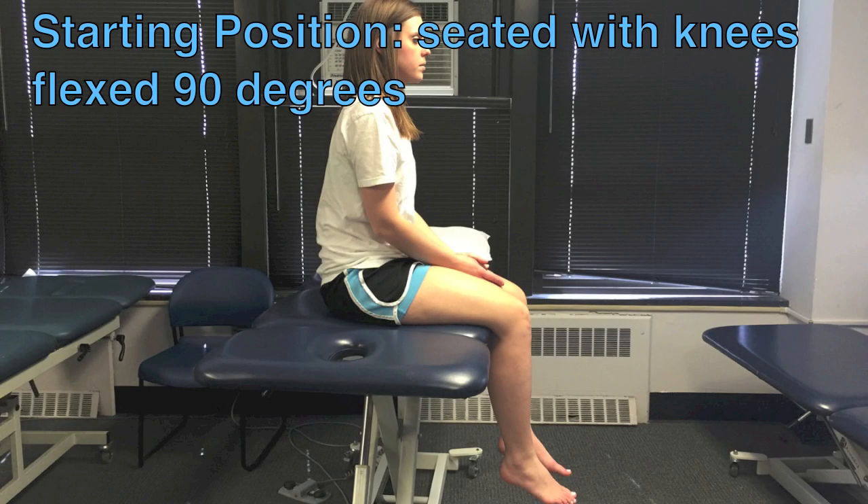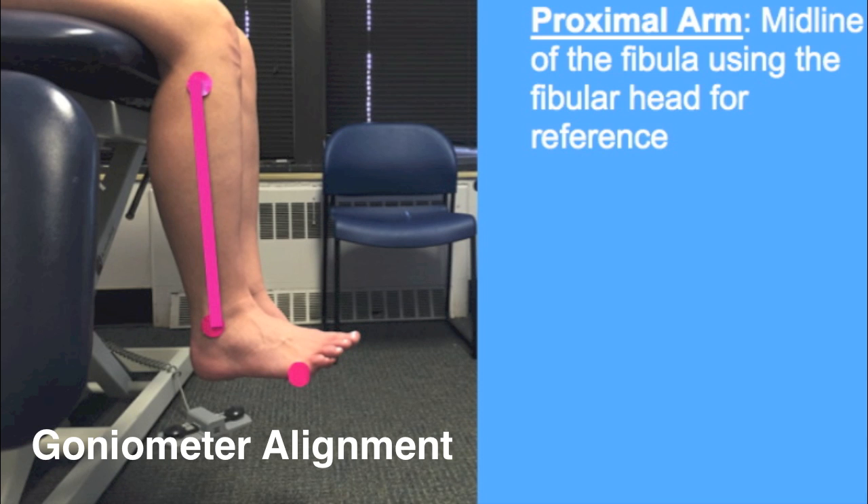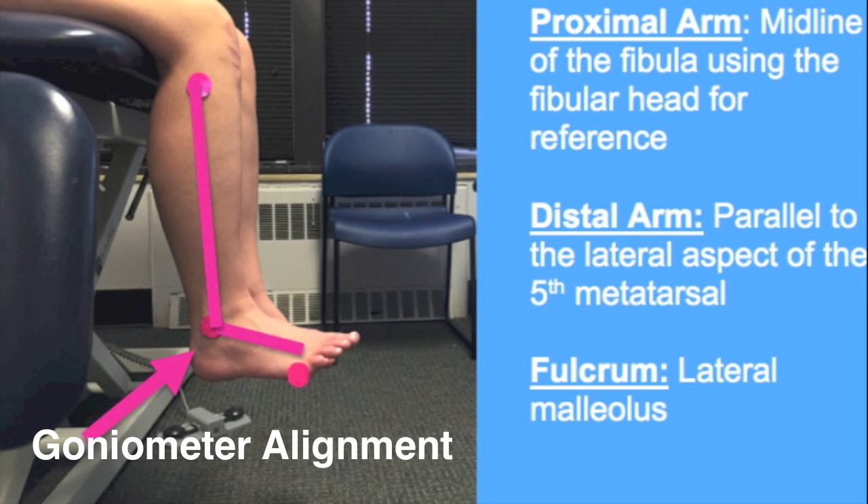The patient is seated with knees flexed to 90 degrees with the foot in 0 degrees of inversion or eversion. The following goniometer alignment applies to both ankle dorsiflexion and plantar flexion. The proximal arm should follow the midline of the fibula using the fibular head for reference. The distal arm should be parallel to the lateral aspect of the fifth metatarsal, and the fulcrum is the lateral malleolus.